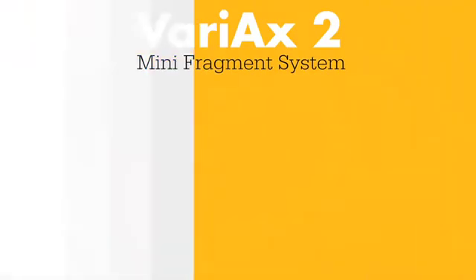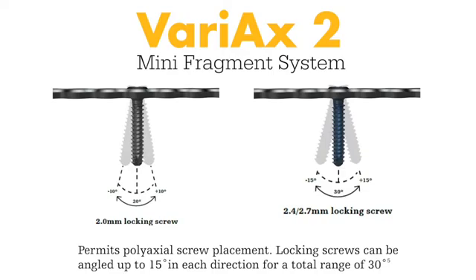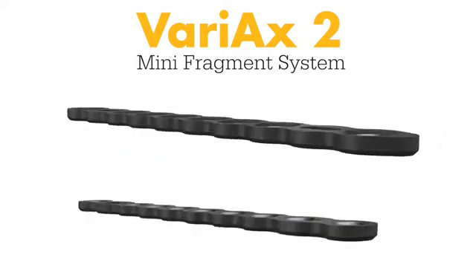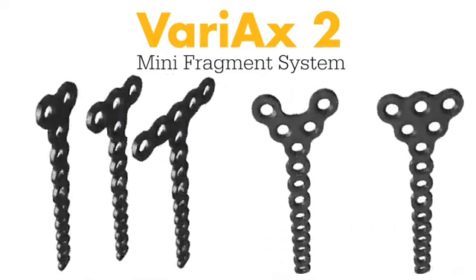The system's locking screws utilize smart lock variable angled locking technology. Each plating module includes a wide variety of plate options including broad and narrow straight plates, as well as narrow plates in T, Y, and triangle designs.